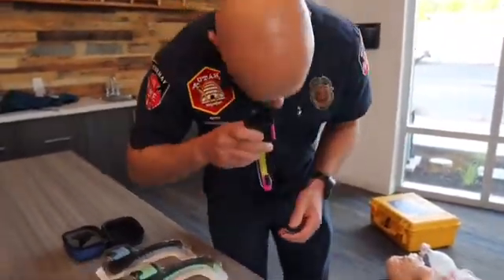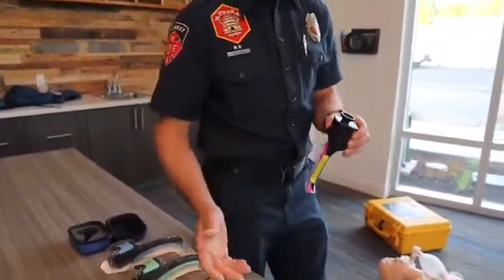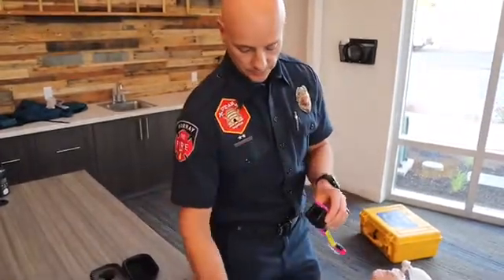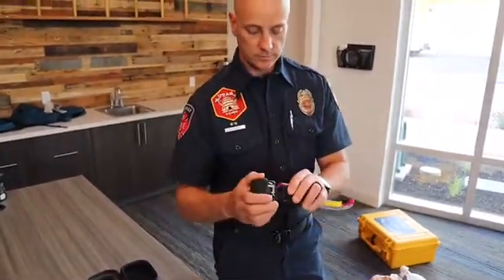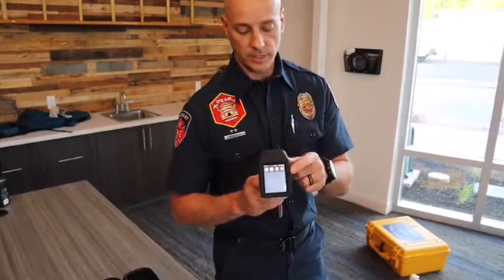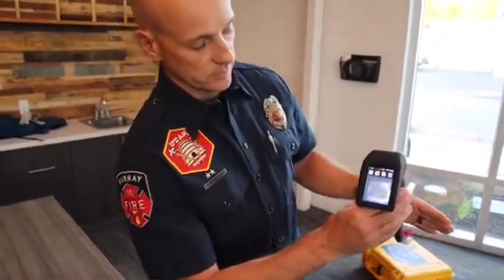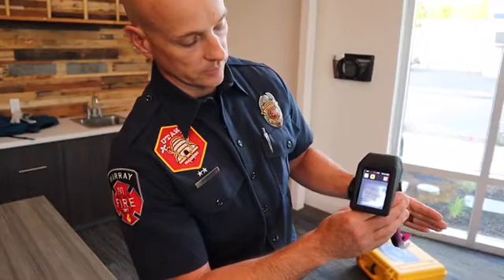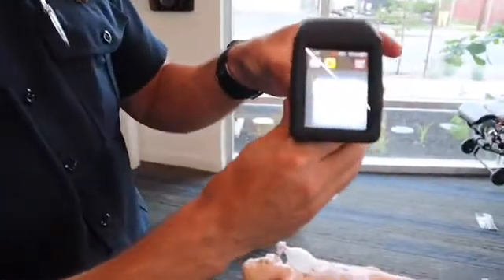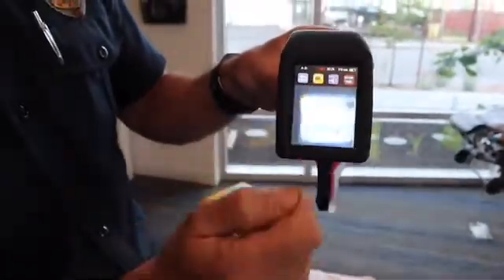When you pull it out of the packaging it has an eye cup — you can actually insert the device and visualize through the eye cup, but then you're having to lean over a patient just as you are doing a regular endotracheal intubation. So for the most part we remove the eye cup and attach the camera to the blade. Once you attach the camera to the blade it powers on automatically, gives you the battery indicator, and gives you an LCD screen that shows a picture from the distal end of the blade where the camera is. We have ours programmed to start video recording automatically as soon as it's set up, so we don't forget to push the record button.